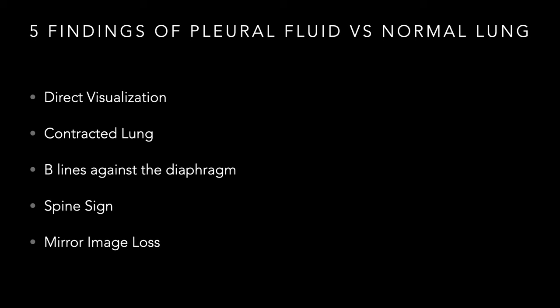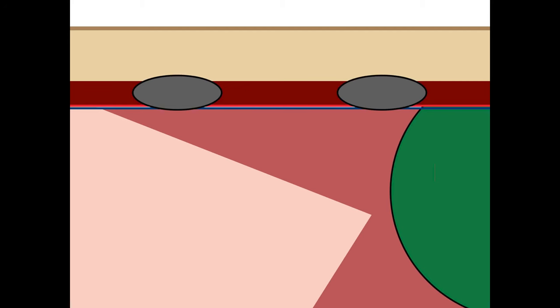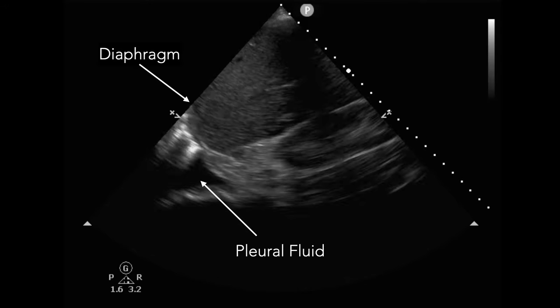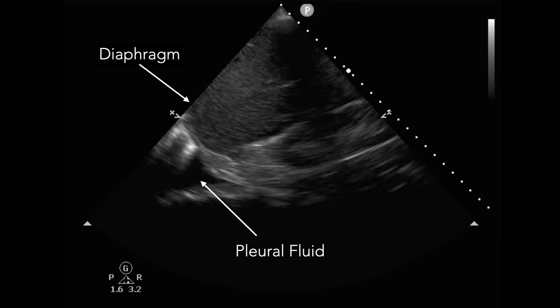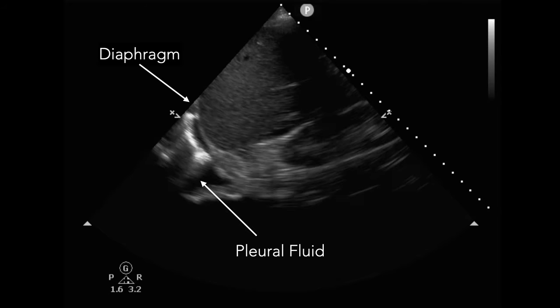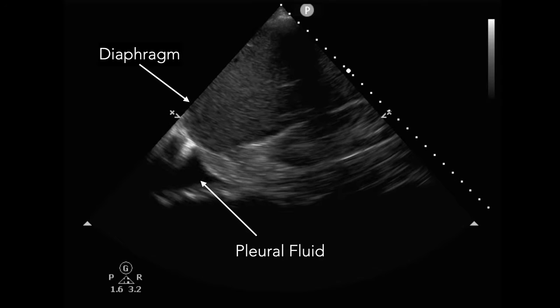The first finding is direct visualization — as the name implies, it's just seeing fluid. Here's the right upper quadrant view. You see the liver and kidney, identify the diaphragm — that bright white hyperechoic line above the liver — and you can see there is some black anechoic fluid existing in that pleural space. You can just directly see it. It's pretty obvious once you know what a normal looks like, you say: this is abnormal. This is an example of direct visualization; in this situation it's a pretty small effusion.